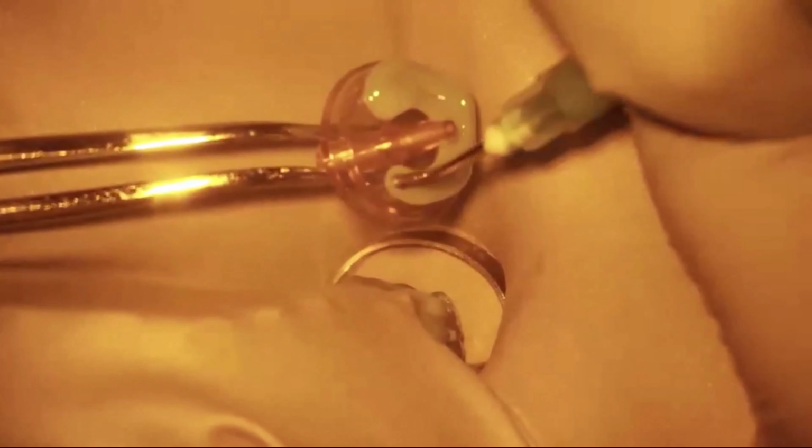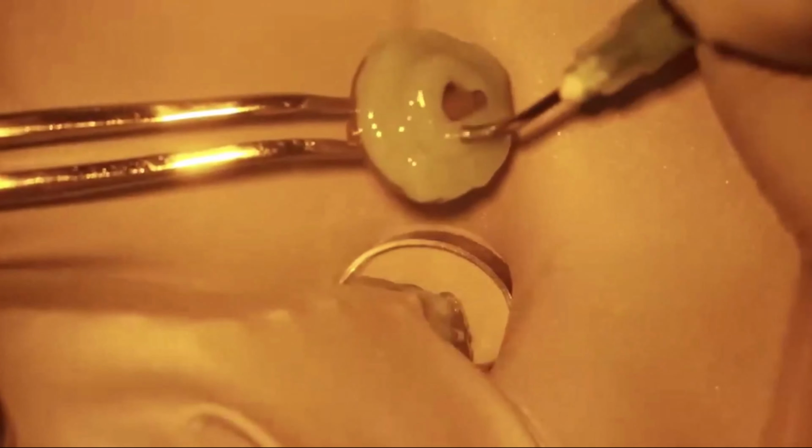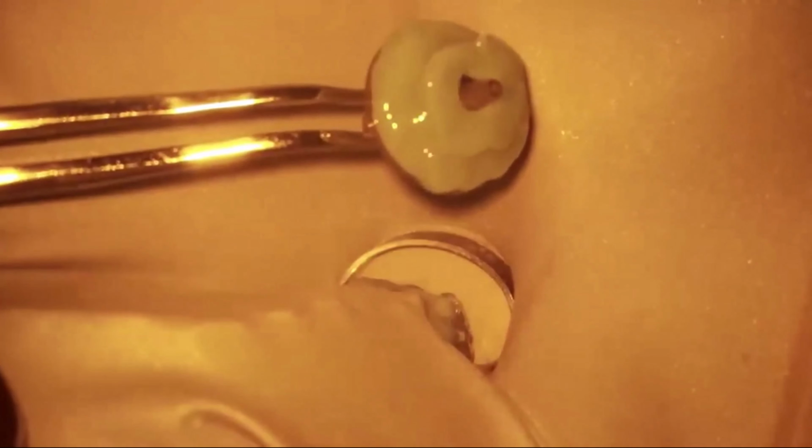You want to minimize the chance of any type of opening to inhibit Gentlewave from working, and you want to polymerize that quite well. Every time I seat that matrix, I want to make sure it's actually fitting properly into that access chamber. And then I just flow the Sound Seal all around, just like this. And I seat it. That's it. Make sure it's sitting well.